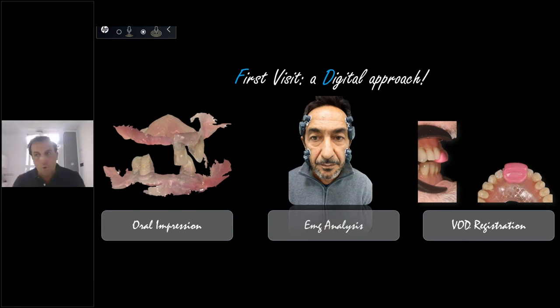It's not so important, it's true. But in the same patient, I want to have the same position of the probes during my exams. So if I take an exam today and I put the probes this way, touching the muscles in the anterior part of the skull and the masseters, I want the same position in the future. So I take this picture with a mobile phone. Do you agree, Valeria?